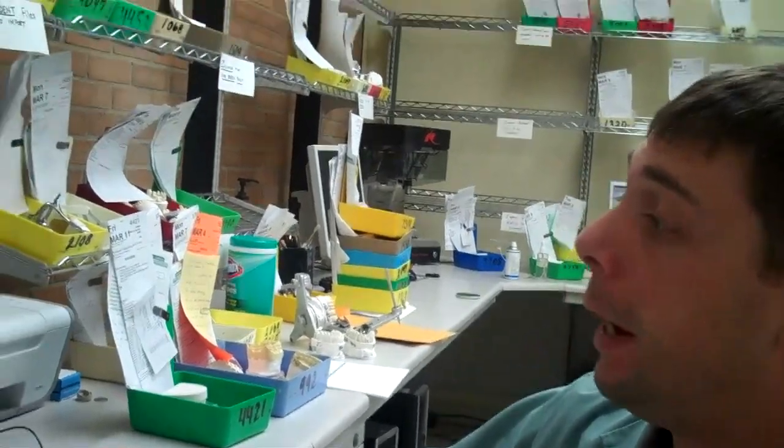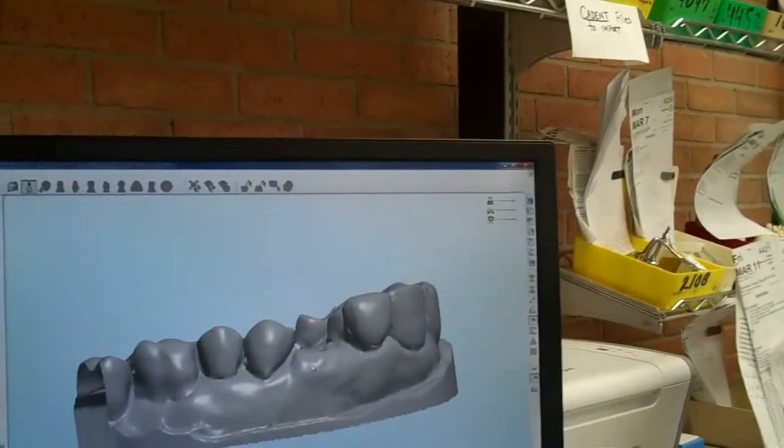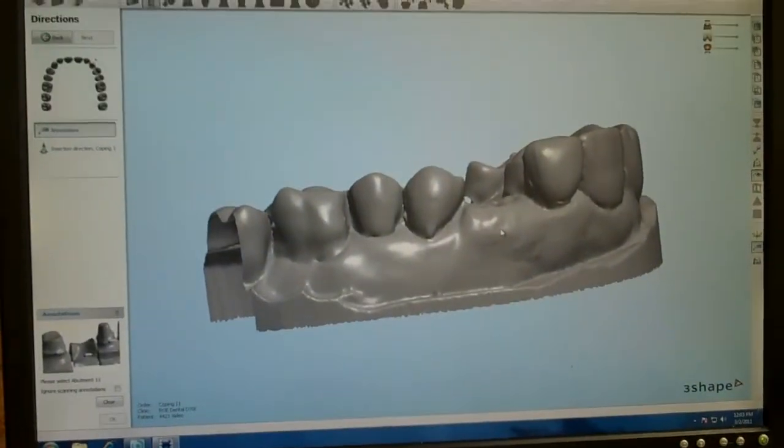For implant number 11, tapered screw-bent, we're going to be designing the abutment and the coping at the same time.